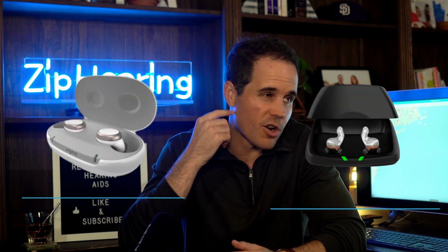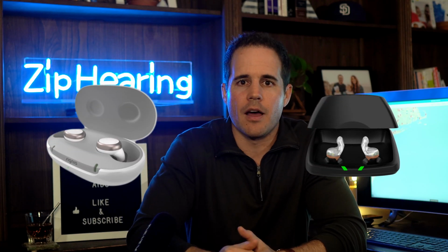Finally, you can't get rechargeables in small in-the-ear devices. There are some, but they're pretty big at this point. This should change in the future, so if this is what you want, just click there and we'll let you know if it exists yet.